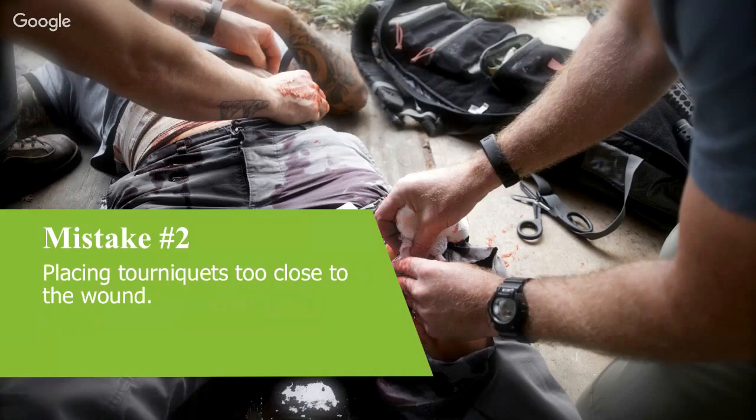If you can see the wound and there's one clear wound, go above it. If it's unclear or there's a tactical environment, high and tight, and then revise it when you can.